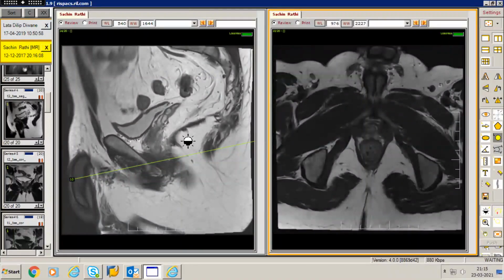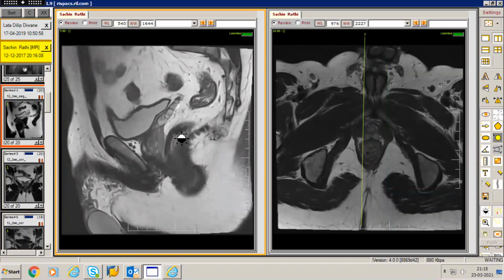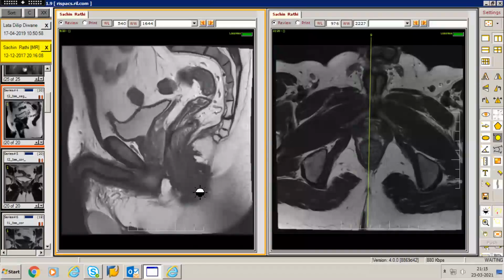That's good. Okay. So now, if you were to look at the sagittal images, this, of course, is a male patient which we have here. All of us are familiar with the pubic symphysis here in the front, the urinary bladder, the prostate, the seminal vesicles, the anal canal, and the rectum. Now, this is the anal verge. The inferior most band-like structure, which you can see here on the sagittal image, that is the anal verge.